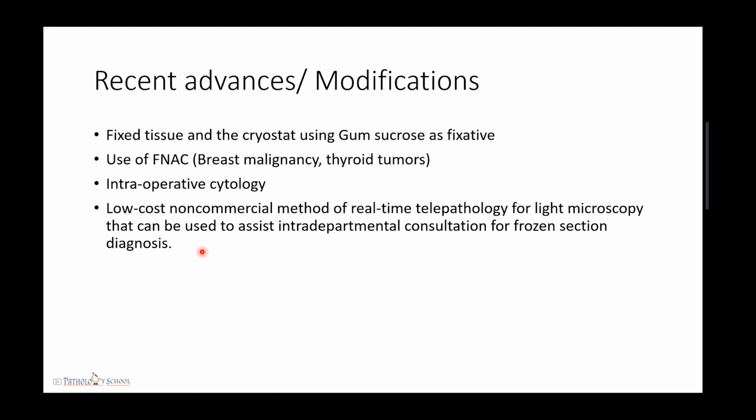Then there is a low-cost non-commercial method of real-time telepathology for light microscopy that can be used to assist intra-departmental consultation for frozen section diagnosis. Like in our institute, we use this real-time telepathology while diagnosing CNS tumors.